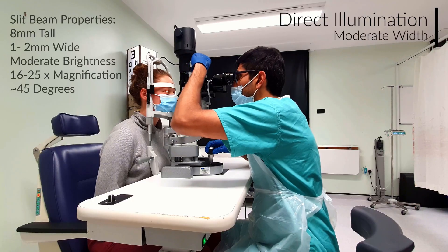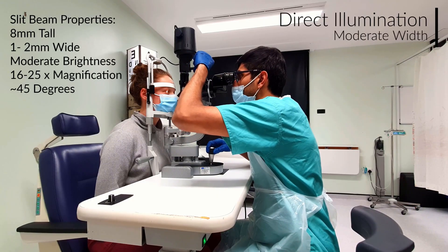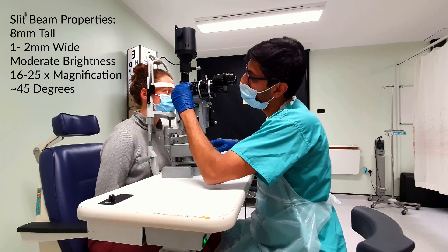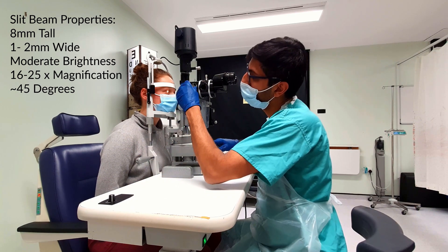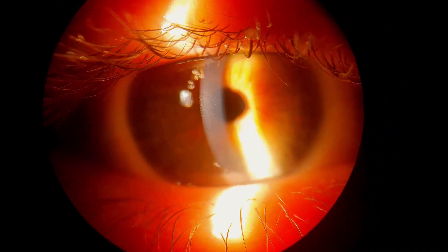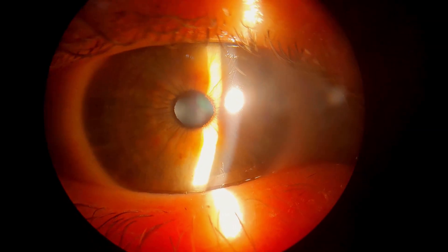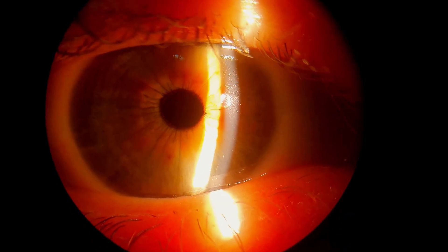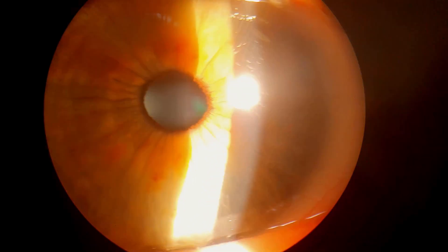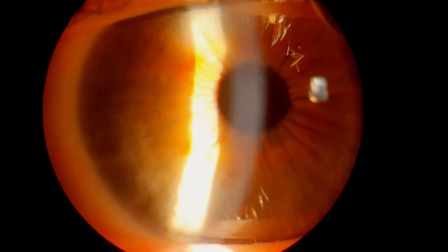Let's look at the moderate width first. Use a tall slit beam which is about 1-2mm wide, which is moderately bright. You can go up to 25 magnification if required. This will give you a moderate slit beam which can be used to directly view structures with high contrast. You can use this method with slight adjustments to see other structures by dynamically moving the illumination arm angle.